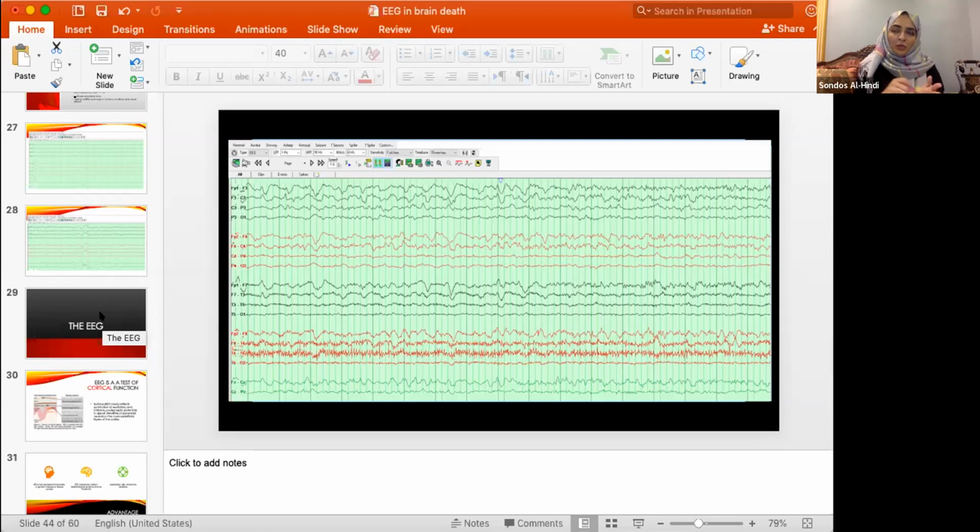I didn't talk about checking for impedance, checking for connectivity issues, checking for 60 hertz artifact. These are non-physiological variables that would affect your EEG. Physiological ones, apart from your heart and medication, of course, sometimes you can't avoid. I've given you an example of a few EEGs I've recorded at my hospital, and some of them are beautiful in terms of technical quality, and you don't have many confounding factors. Sometimes they're difficult. The patient might be sweating, and you'll be developing sweat artifacts. So the technician has to be wary of that and try to eliminate any non-physiological confounding issues in your EEG.